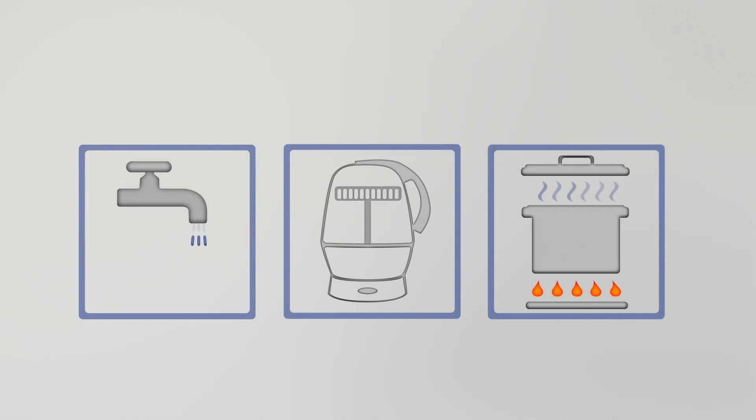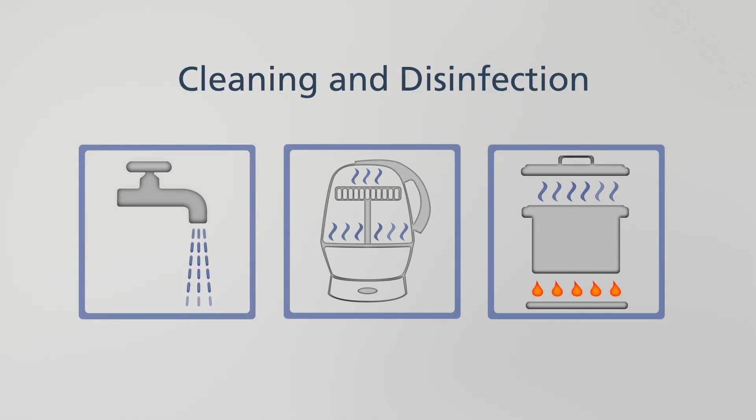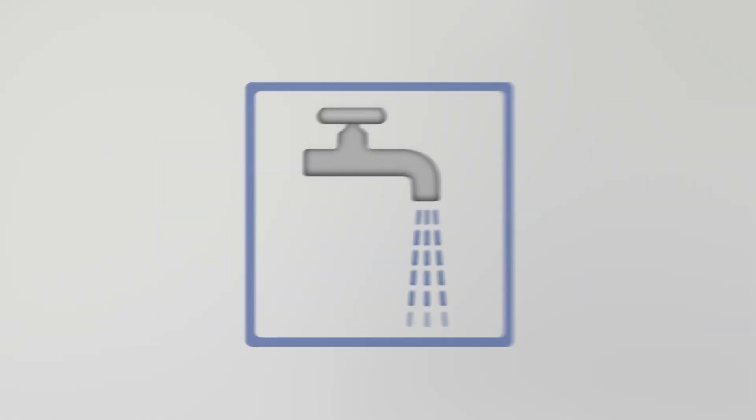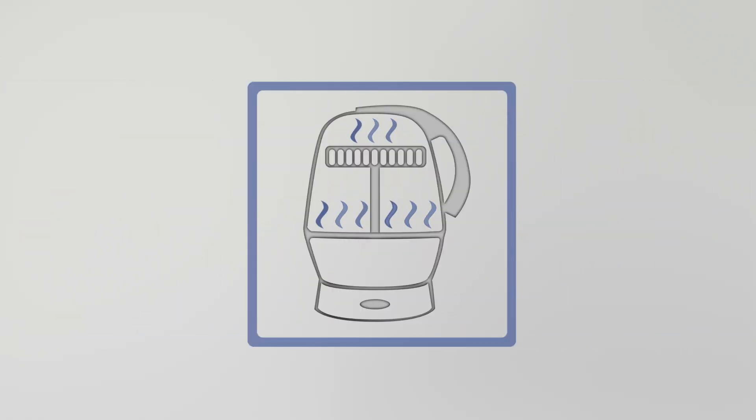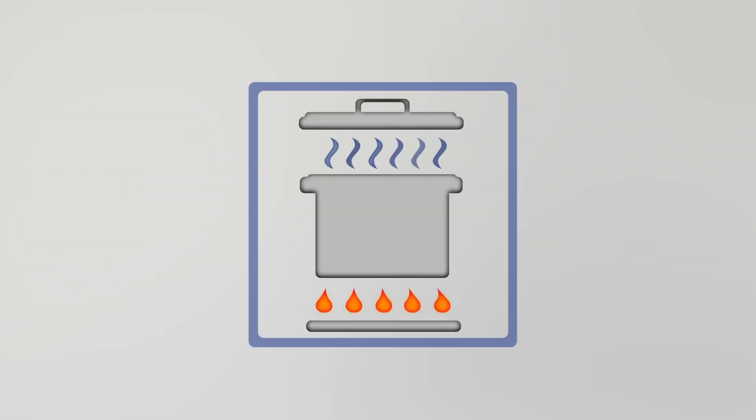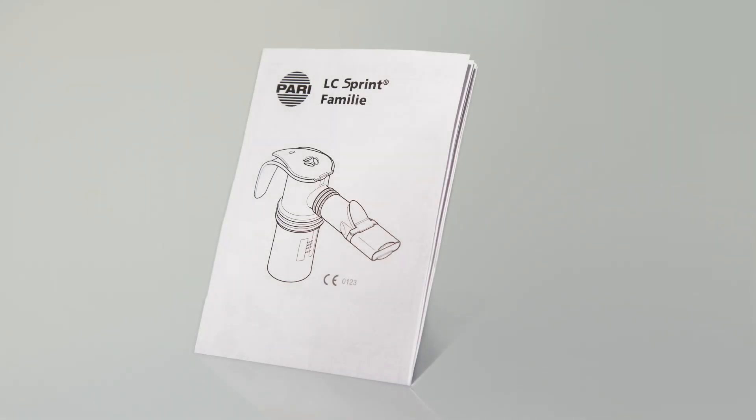Clean the Pari LC Sprint Nebulizer after every inhalation session. This can be done very easily and quickly with lukewarm tap water. Please also disinfect the nebulizer once a day — you can use a thermal disinfector for this, or simply place the nebulizer in boiling water for five minutes. Then allow the nebulizer time to dry completely. Always read and follow the instructions regarding use and cleaning that accompany your Pari inhalation device.